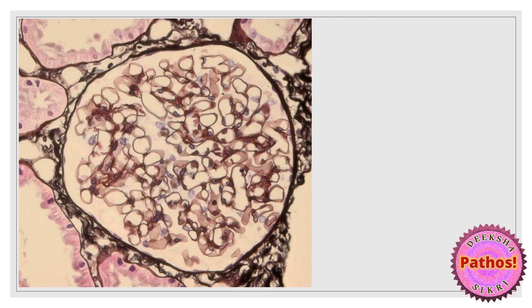This is a silver stain — the Jones methenamine silver impregnation method. Anytime you get a silver stain, you'll get a black-on-pink appearance. You see a nice pink background with whatever is silver-positive appearing in black. The capillary outlines, Bowman's capsule, and tubular basement membranes are all highlighted really well with the silver stain.